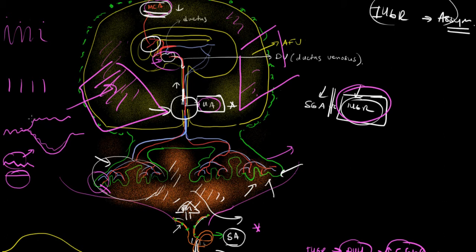And so that, once again, it's a measure of two things. It tells you conceptually how good the reserve of the placenta is, but also once the baby's failing to accelerate, that suggests that there's already some hypoxia or anoxia, that the baby's irritated already. So if you have a non-stress test that's non-reactive, then you have to do other further testing. So that's what I showed. So that's part of this biophysical profile.